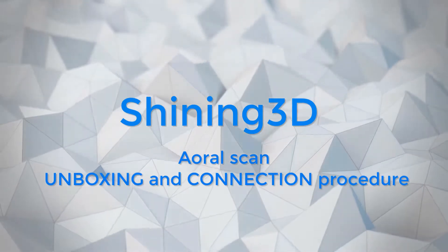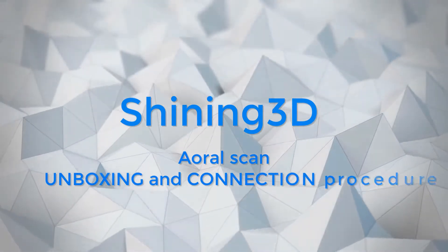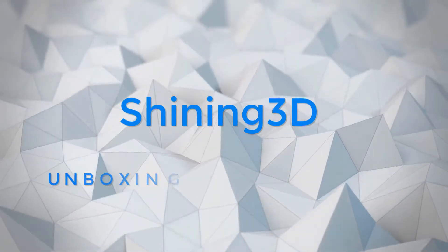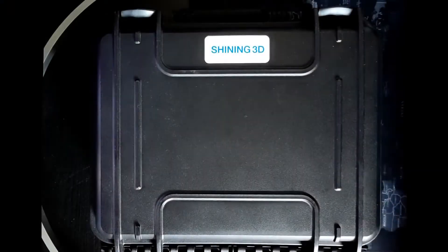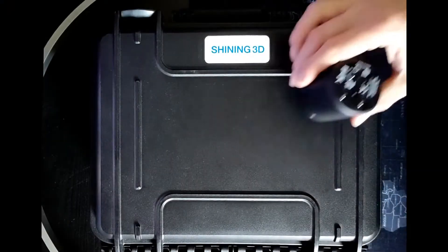Hello, it is Filippo. Let's start checking together how to unbox and connect the oral scan.